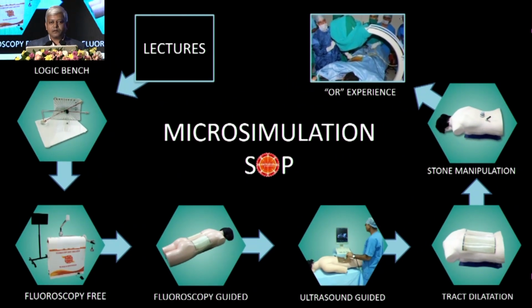So in our concept, we break the steps of, say, percutaneous renal access or PCNL into micro-simulation. That goes with lectures. Then each step of the surgery is taught to the student, and then finally the OR experience is provided.